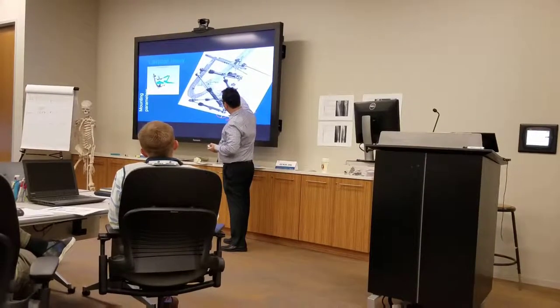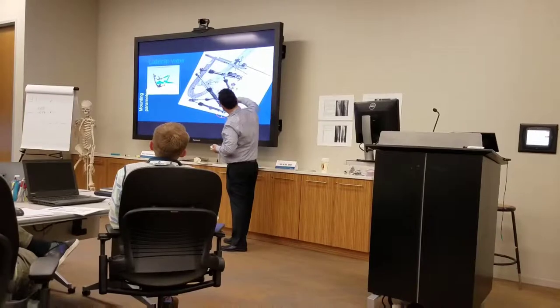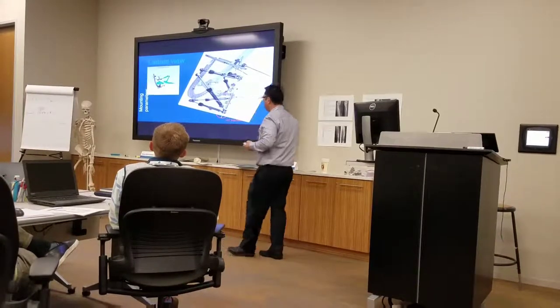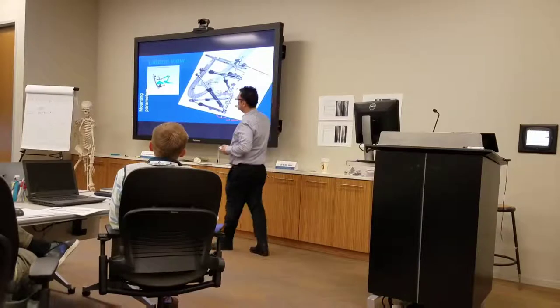In the lateral view, is it translated plantar? Is it translated dorsal? Is it tilted anterior? Is it tilted posterior? These are the things you want to get into your head. Also, they want to know how far it is from the osteotomy.